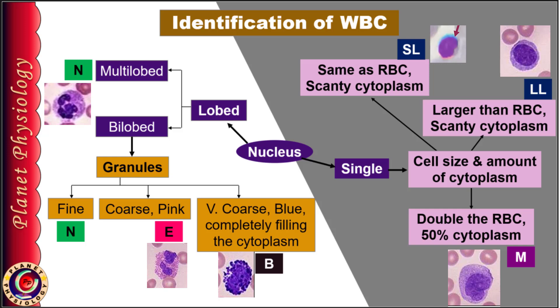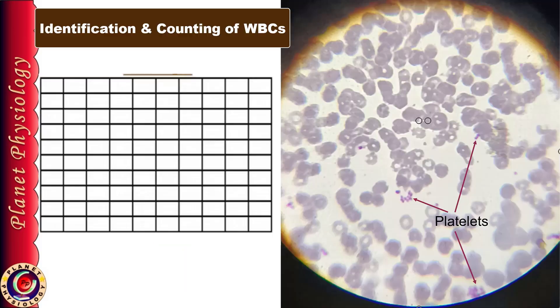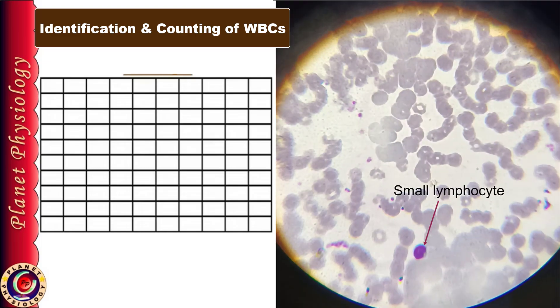If you remember these important key points, identification of WBCs is an easy task. Now let's visualize the smear under the microscope and try to identify and count the WBCs. Currently, this field is showing only RBCs and platelets — some are in bunches, some are separate. Move your smear slowly till you come across a WBC. Here is your first WBC, and it is a small lymphocyte because the nucleus is single and occupies almost the entire cell, and the cell size is the same as that of an RBC. You can also note very scanty cytoplasm near the indentation of the nucleus. Note it as L in the first box of the observation table and move forward.